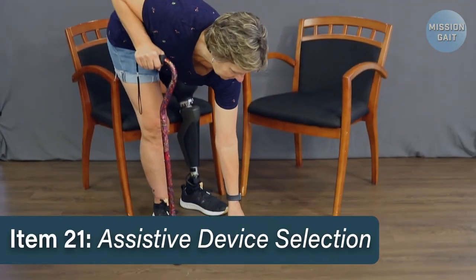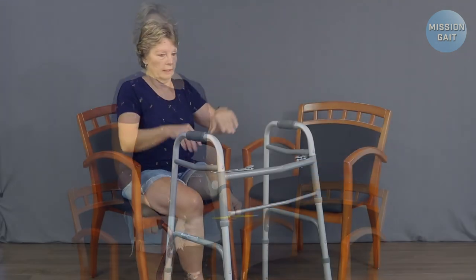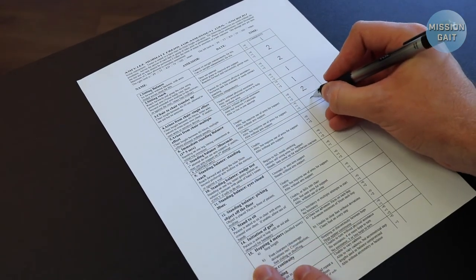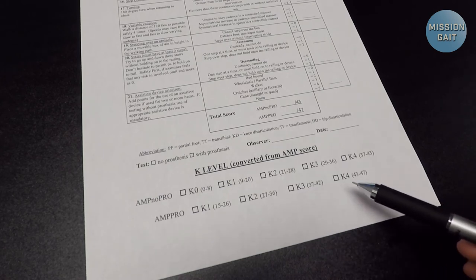Item 21, assistive device selection. For the final item, score for the assistive device used by the patient for at least two of the test items. Once all test items have been completed, add all scores up to receive the patient's score for the AMP Pro or AMP No Pro. While documenting, ensure that you have noted which test version was performed. When compared with normative data, this score can be utilized for prosthetic prescription through the use of the patient's K-level, and it can also be utilized for outcome measurement during rehabilitative care.